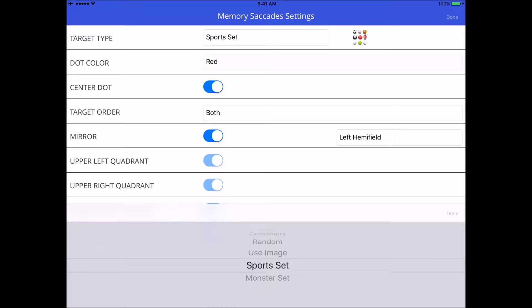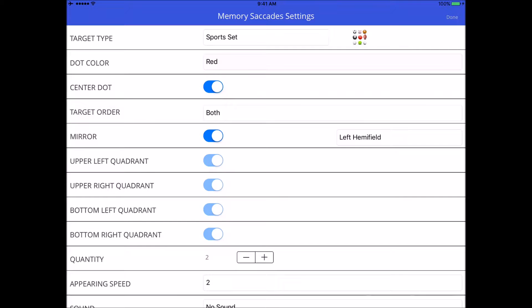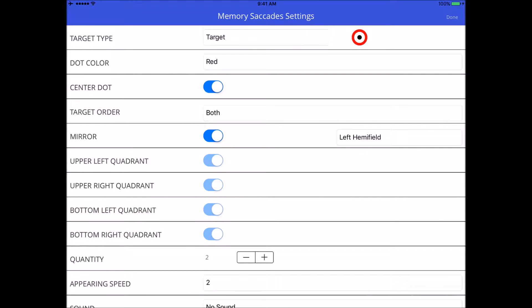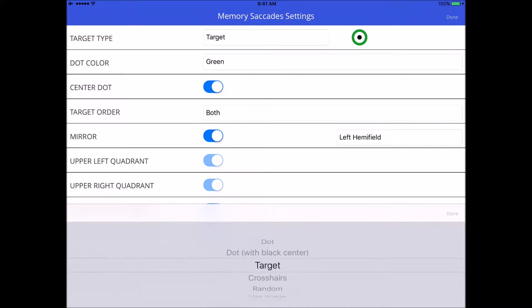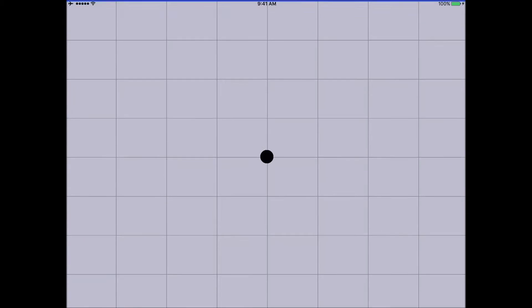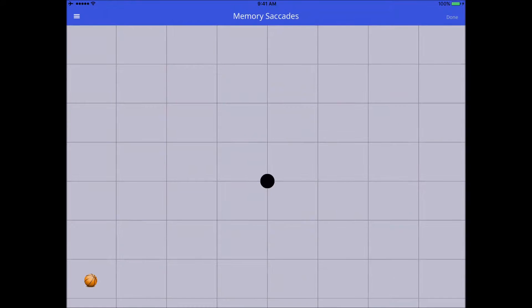We'll leave it on sports set for now. The next option is dot color — like other exercises, you can change the color if using a different target type, but we'll leave it on sports set. The third line is center dot, which I always leave on. Basically, in the center of the screen you'll have a black fixation dot, and the screen will look like a grid with that black dot in the center.